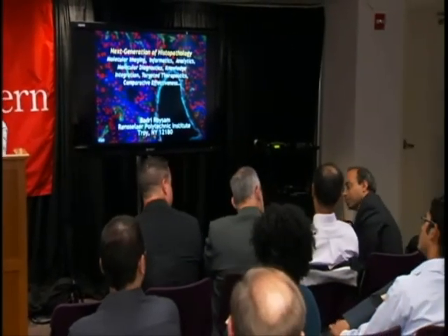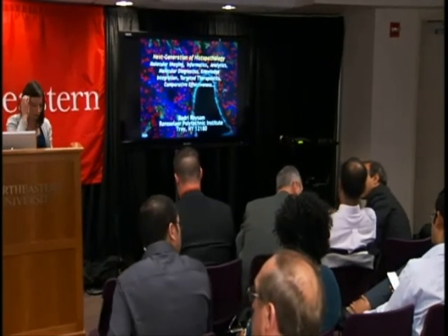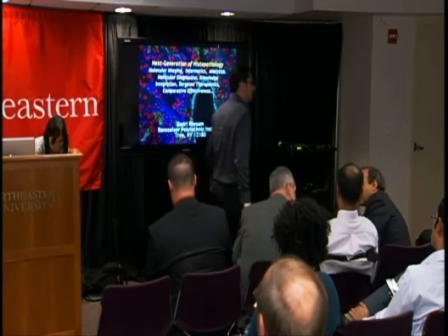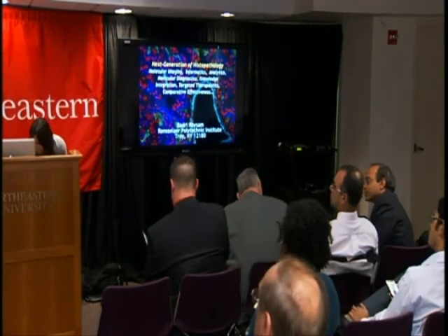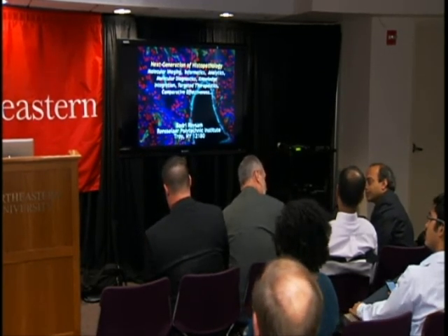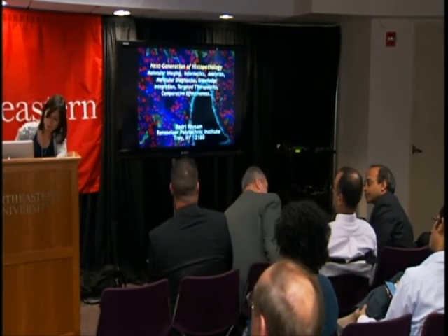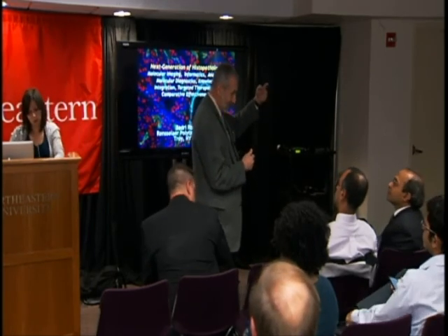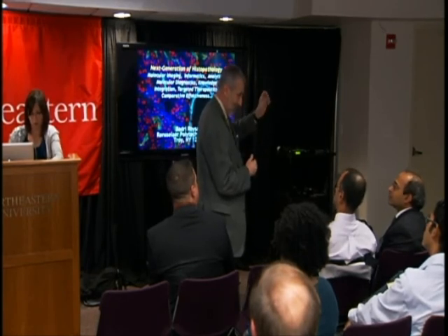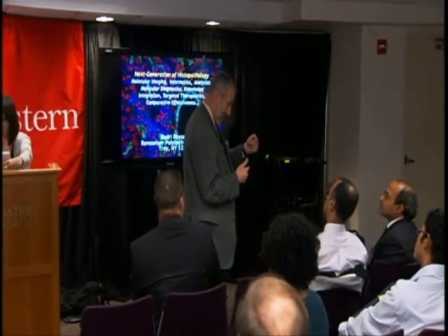Go ahead. I have a question for Chuck. How do you know that you were indeed looking at melanin, and how did you get so much signal out of the 3 photons without a pulsed laser? The question is, how did he get so much signal without using a pulsed laser? The second question was the strength of the signal. In a normal 3-photon process, the intermediate states are virtual states. If you think of it quantum mechanically, it's third-order perturbation theory, so it's a very, very weak signal. In this case, you actually have real states to excite.